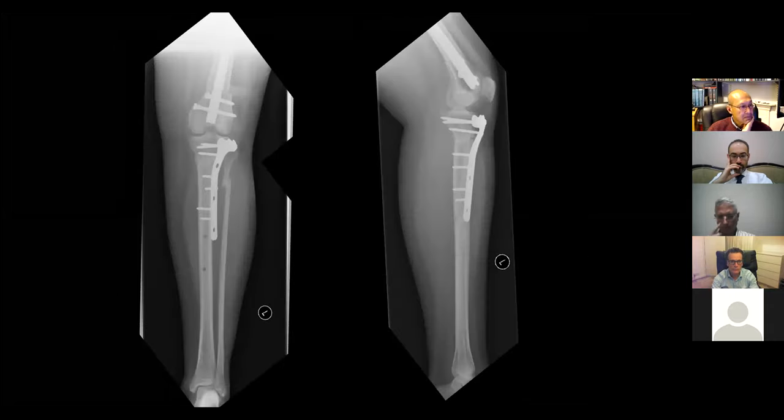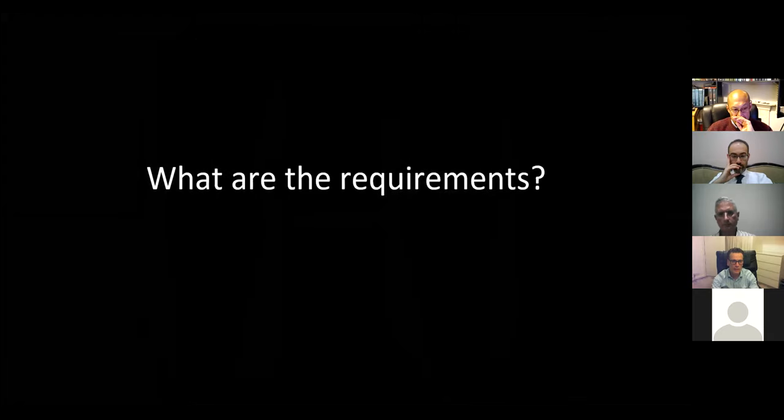Pins were placed at 90 degrees, and then the correction was performed with the external fixator assisted method, providing the desired radiological and clinical outcome. As I was explaining earlier, we're deliberately not aiming to fully correct the deformity of the sagittal plane, in order to match the hyperextension profile. Otherwise, this patient will have a slight flexion deformity. And these are the images at healing.